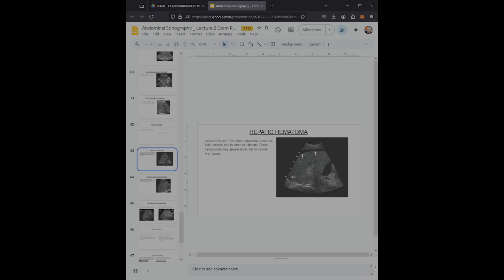Initial hemorrhages appear echogenic with the development of a clot, and over time it resolves, and it may appear more cystic and complex. Focal hematomas have been known to calcify, and therefore in the acute stage an intrahepatic hematoma may be difficult to visualize.